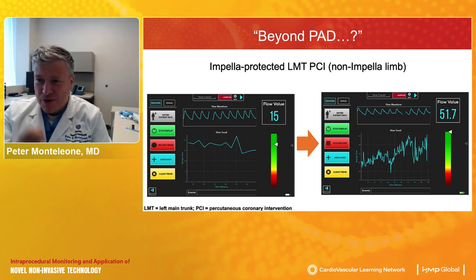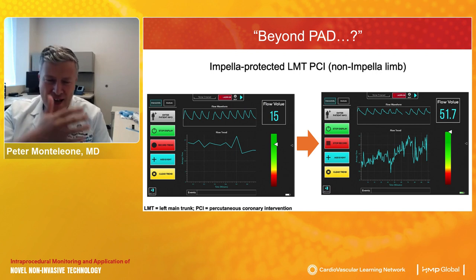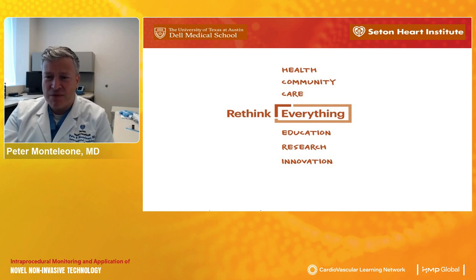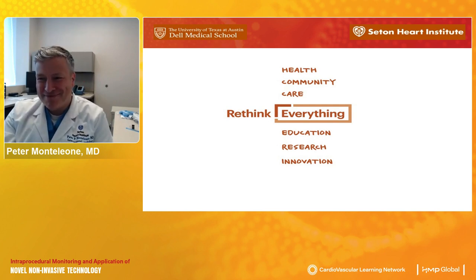If anything, we had a needle puncture into that artery and a closure device post. But the fact that we improved probably contractility in cardiogenic shock in this situation actually showed us improvement in the limb. So we didn't see malperfusion secondary to the sheath. We actually saw the clinical sequela of improving cardiac contractility and function. And it speaks to the fact that tissue perfusion monitoring gives us not just anatomic measurement, it gives us physiologic information that really helps guide our decision-making in some of these most complex of cases. And so, with that, I'll stop there.